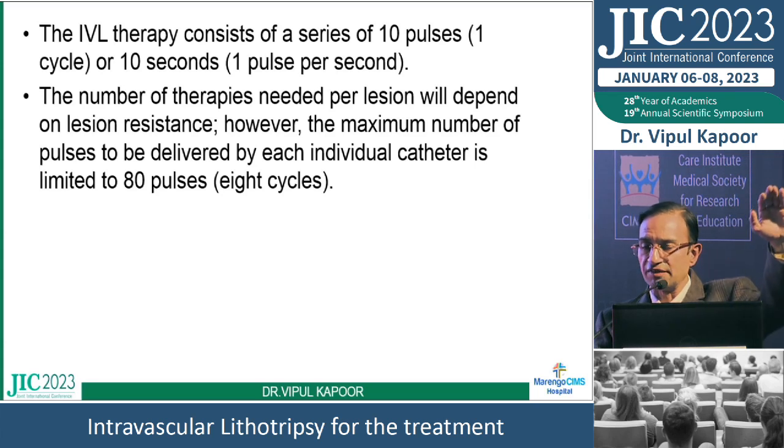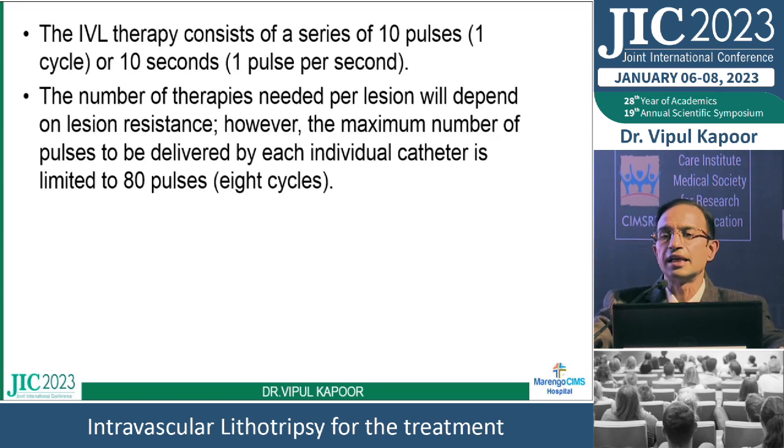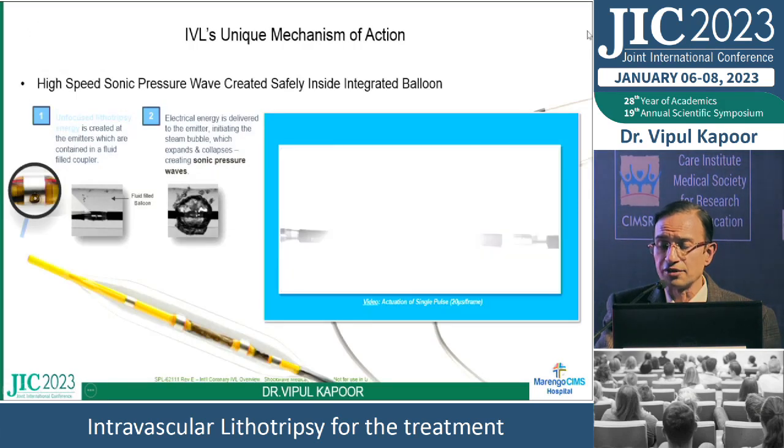Right? Once. So whenever you plan your case, you have to plan it in such a way that the place where the calcium is the maximum, you deliver the maximum shock, and in the remaining segments you can deliver the rest of the shocks, because after that this balloon becomes useless, right? It cannot be used. So you have to take another balloon. The only problem is it's an expensive technology at present. It roughly costs about 3,25,000 only for the balloon. So therefore your usage has to be very judicious, very, very justified, and only in cases where you feel that it is absolutely mandatory, that is where you should, at the present point of time, use it.